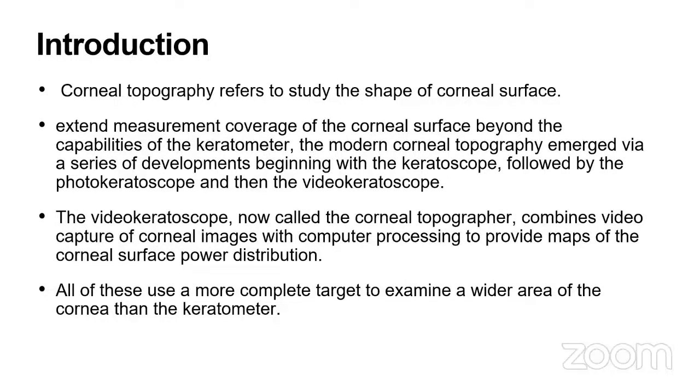Today's topic of discussion is corneal topography. Introduction. Corneal topography refers to the study of the shape of the corneal surface and to extend the measurement coverage of the corneal surface beyond the capabilities of the keratometer.